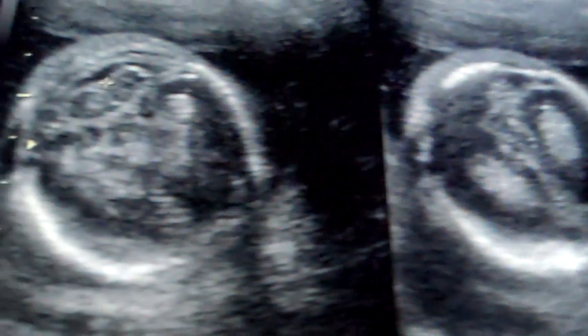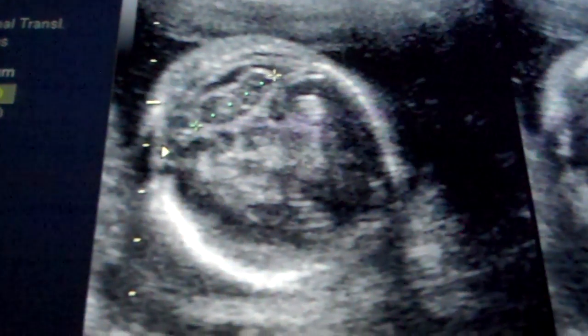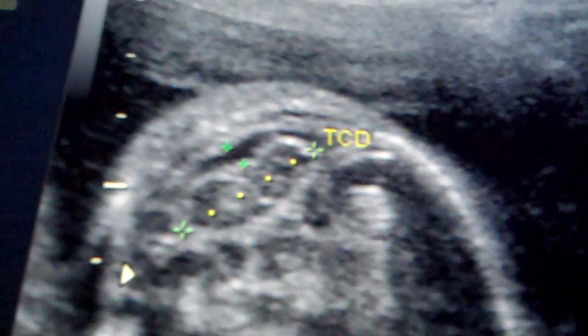This sort of figure eight shaped area right here is the cerebellum. It's the posterior part of the brain, back at the base of the skull. The cisterna magna is this little space behind it. That's all normal.